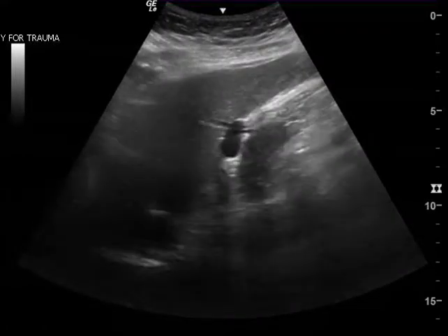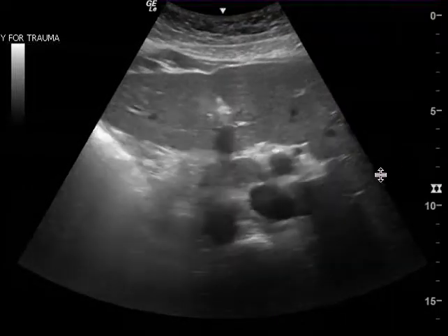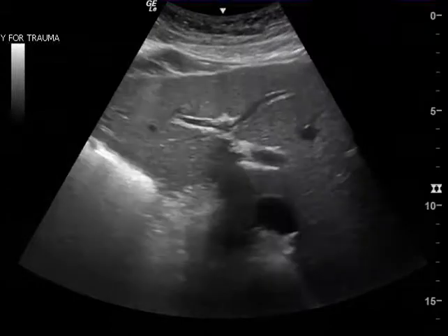You don't see the gallbladder in the second clip either. In the third clip, you don't see it until the very end — it's going to appear right in this area. There's the gallbladder. This is the aorta right here, and there's the IVC. I don't see any gallstones in this clip.